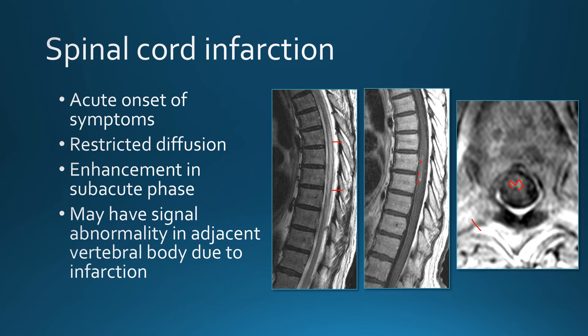On axial images, the enhancement in cord infarction is usually limited to the gray matter — you can see the enhancement pattern in the configuration of the spinal cord gray matter. Occasionally, since the spinal cord is supplied by vessels that also supply the vertebra, you may see infarction of the vertebral body with abnormal signal within the bone marrow at the same level as the spinal cord infarct.